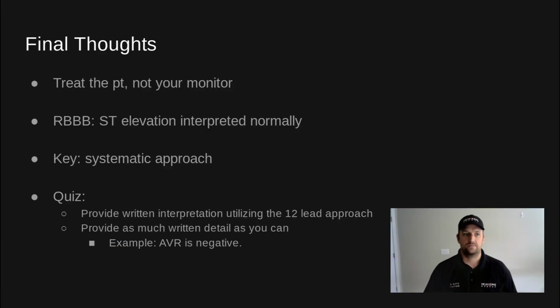Some final thoughts. Always treat your patient, not your monitor. If you have a patient that does not have classic findings for a STEMI, but they have all the normal chest pain symptoms, treat that patient, not the monitor. Next, in a right bundle branch block, you can treat the ST elevation normally, meaning use the criteria you would use if they didn't have a right bundle branch block to guide you for ST elevation.